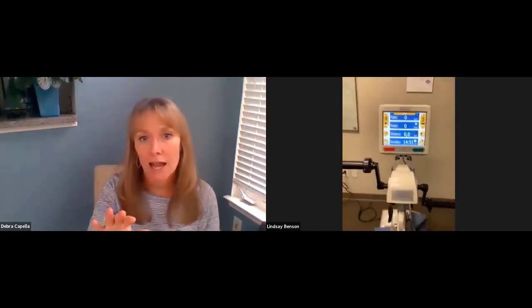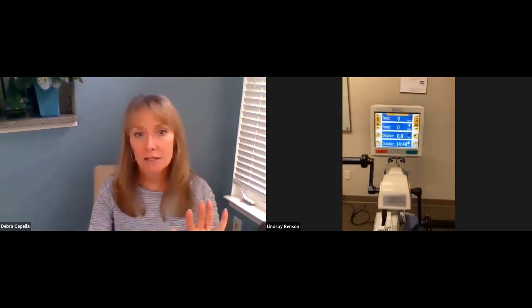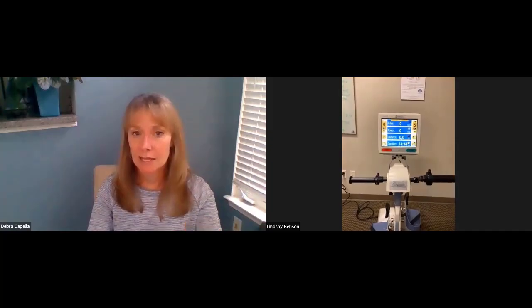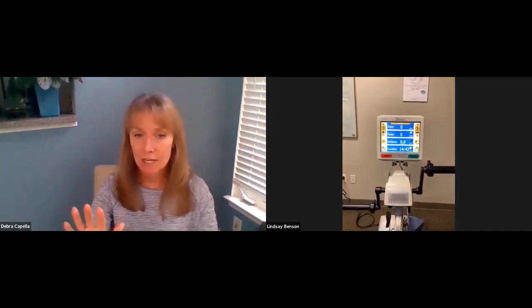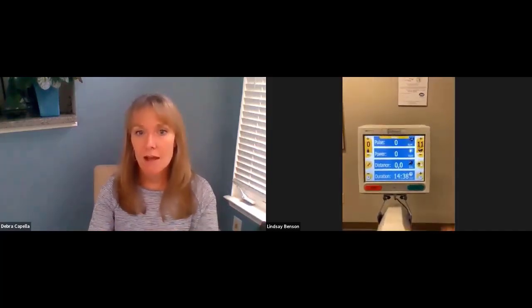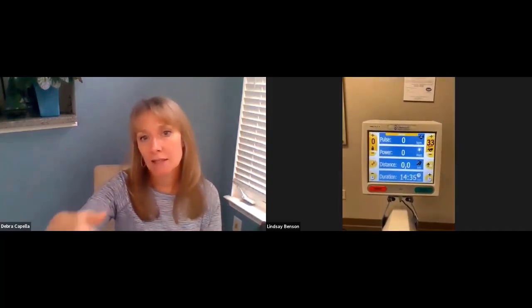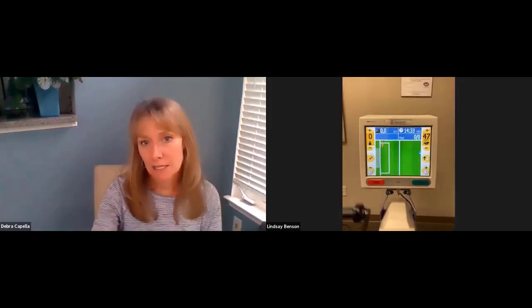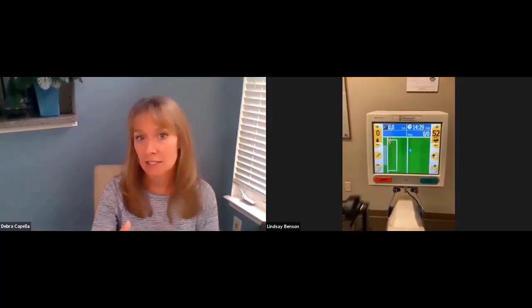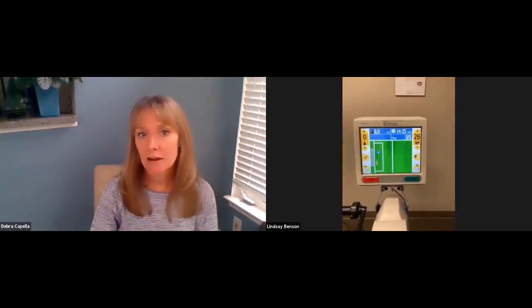So she hits start, and you can see that the cycle is actually going to be moving very slowly at that. Right now it's set on 5 revolutions per minute. She's going to put her hands on that. I hope she can do that. Yeah, there we go. And then you can see automatically, as soon as she starts going faster, the RPM has increased. And now she's onto that goalie net, and she needs to slow down a little bit, Lindsay. Block that soccer ball. Go ahead.